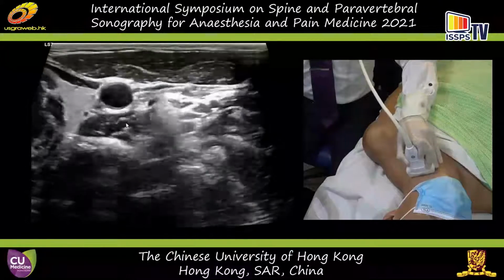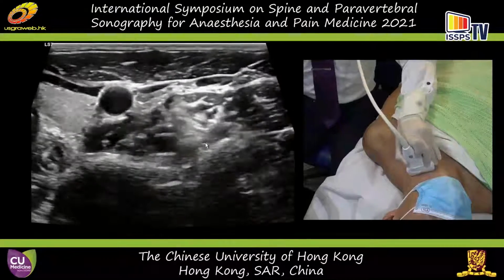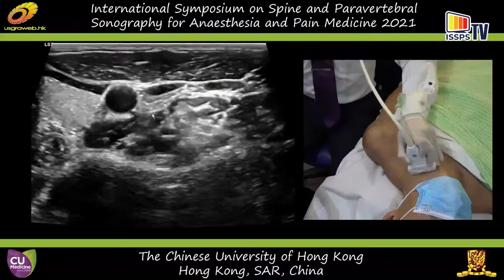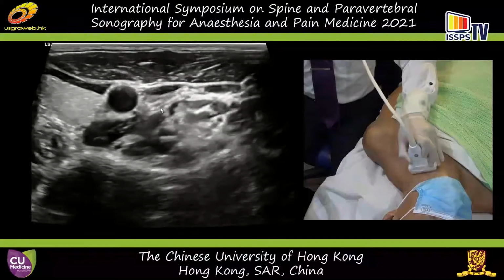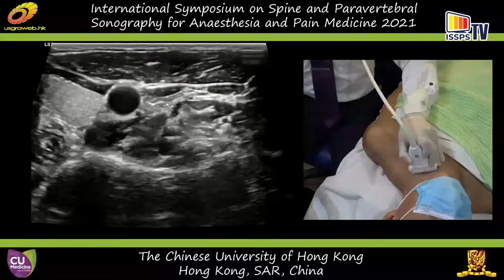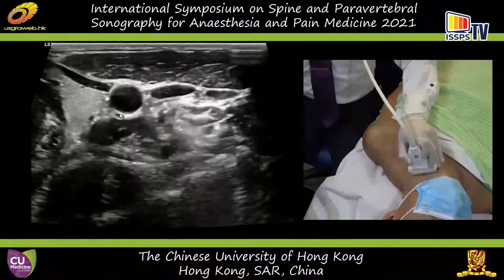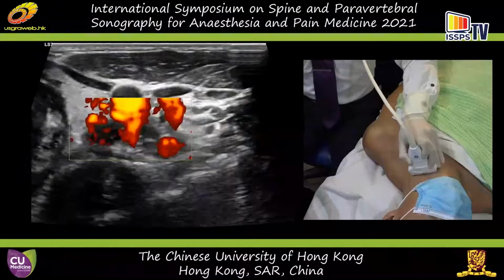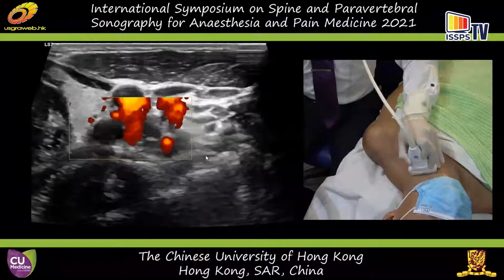So at this longus colli muscle, if I go to the C7 level, as pointed out by Dr. Shankar, if you want to do the stellate ganglion or lower cervical sympathetic block, the better position is to go to C7. Then you get underneath the prevertebral fascia. Be very careful about the inferior thyroid artery, which I'm going to show you, here.